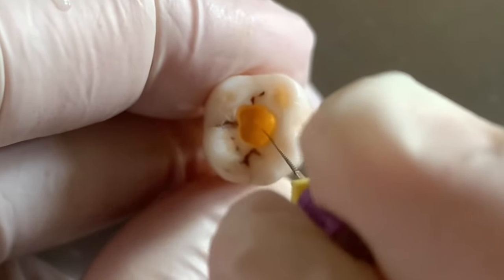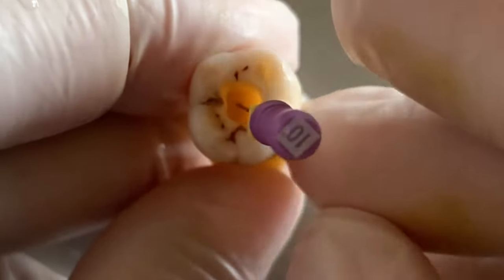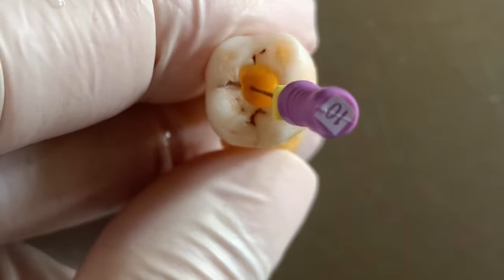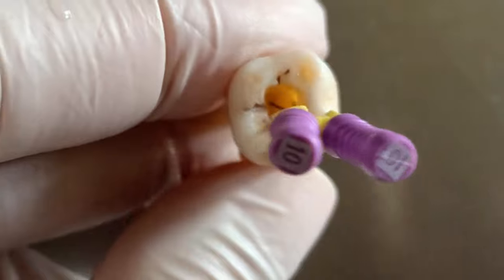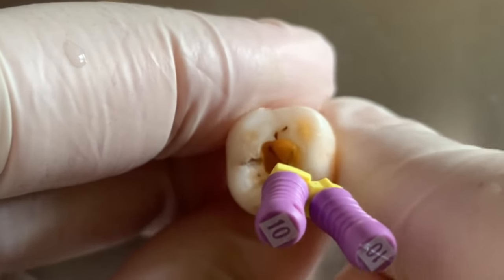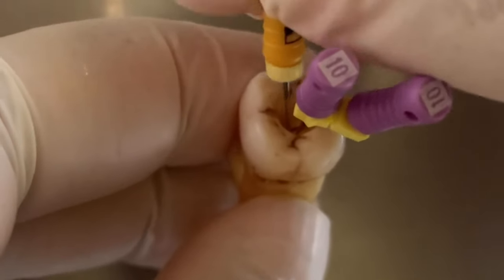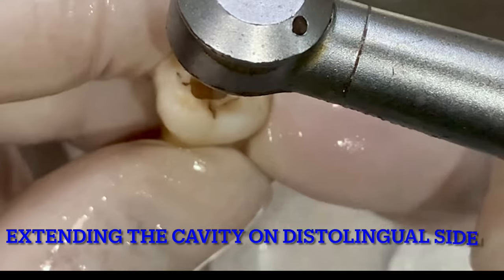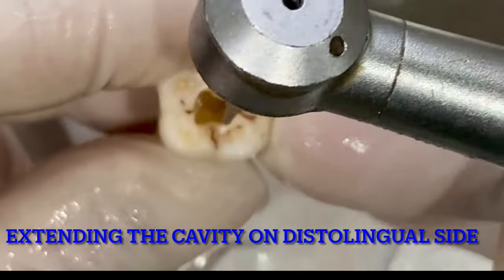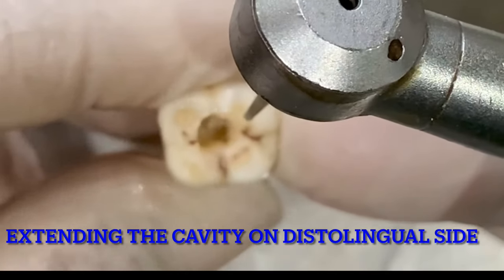Now let us place files in all three canals. First is the mesiolingual canal — here you can put it inside. Next we go in for the mesiobuccal canal, and to go deeper I just gently move it inside. And finally the distal canal — the distal canal that we have found is more on the buccal side.